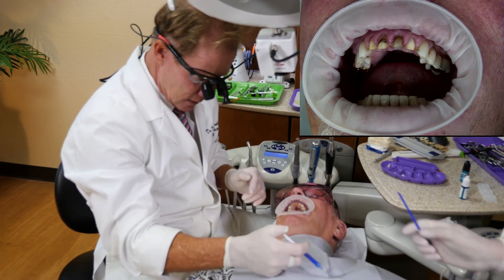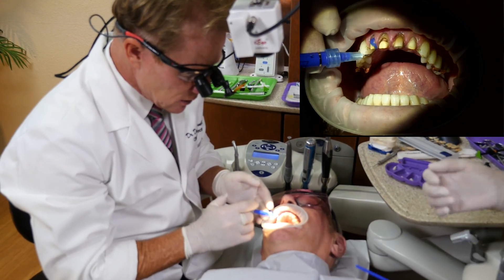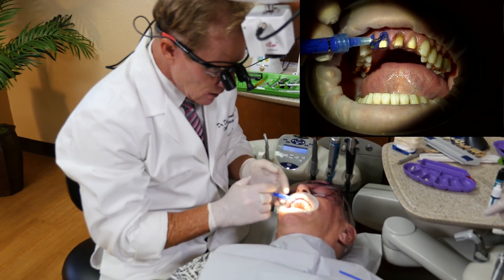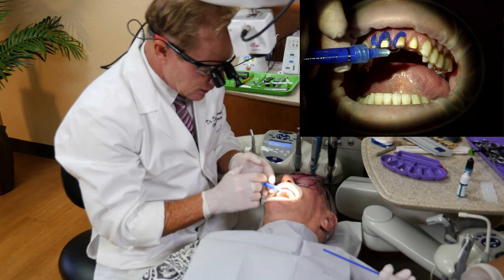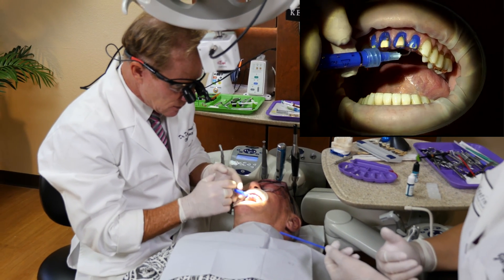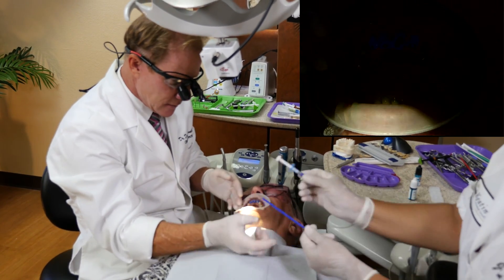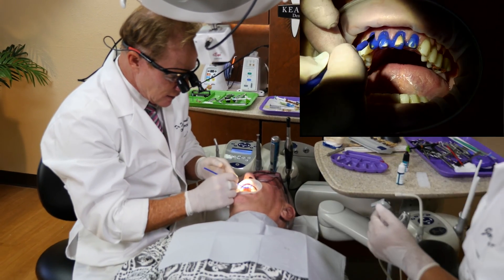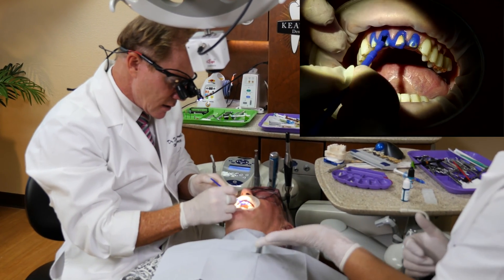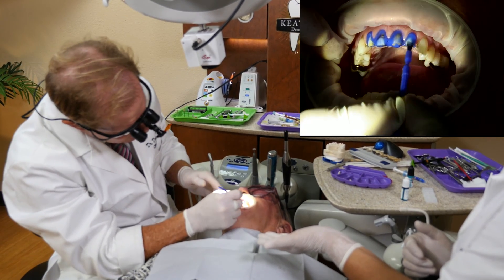We're going to use a total etch technique. Let me know if this is sensitive at all. This is 35% phosphoric acid. Relatively short preps — that's why I like to go with a total etch system. We let this sit for 10 to 15 seconds, making sure that it's on all the prep, both dentin and enamel.